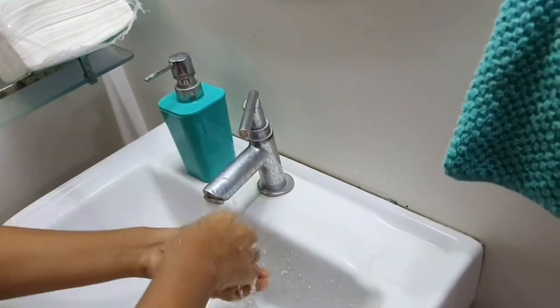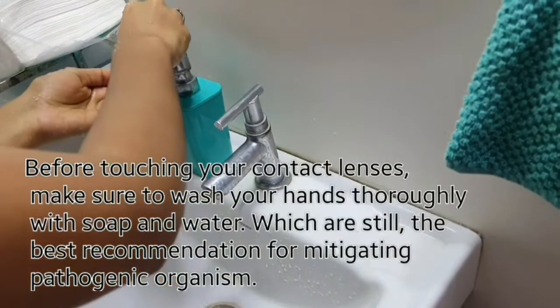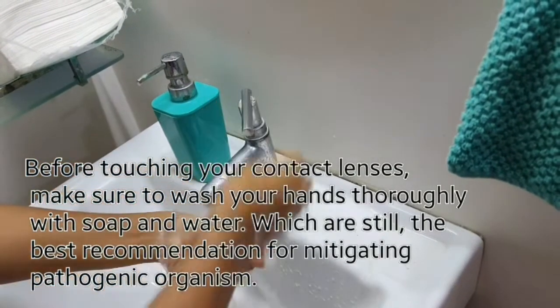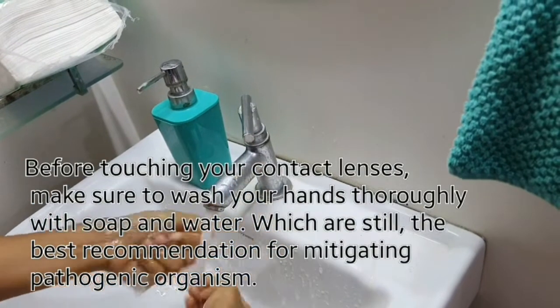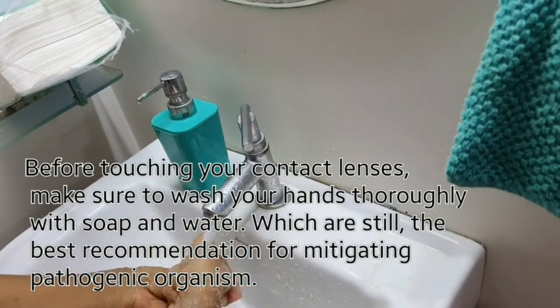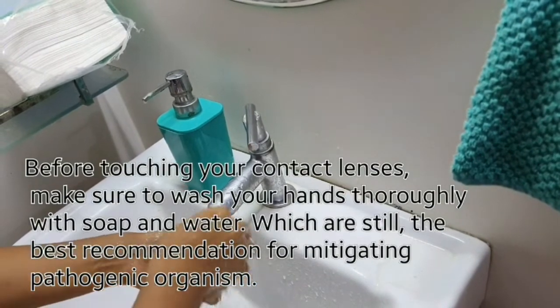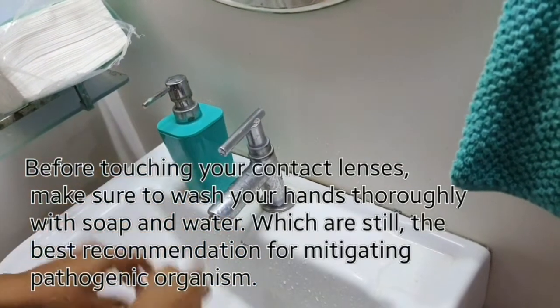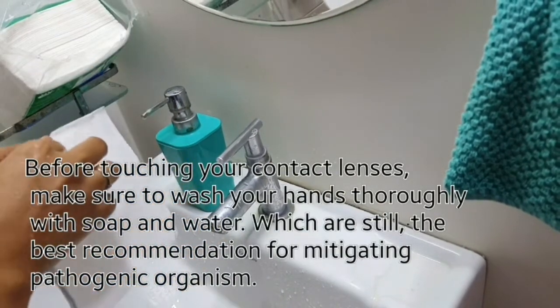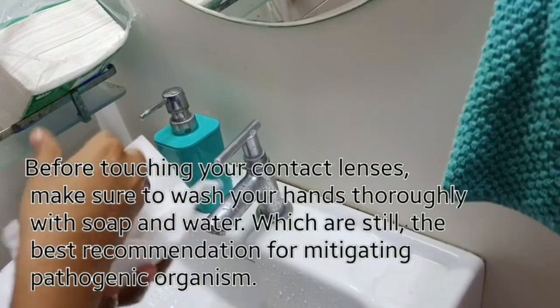Before touching your contact lenses, make sure to wash your hands with soap and water. Then dry your hands with a tissue or towel.